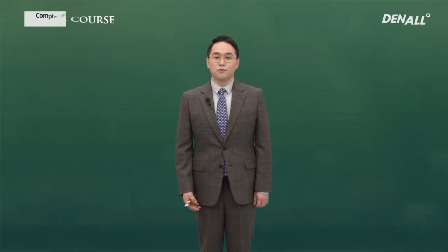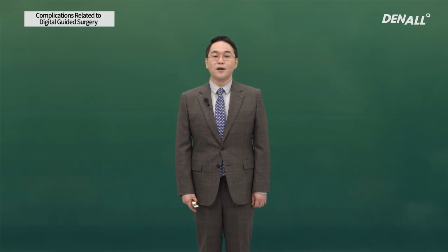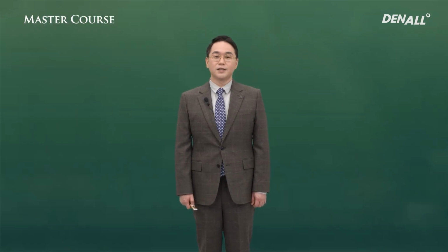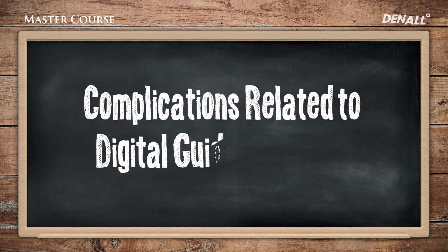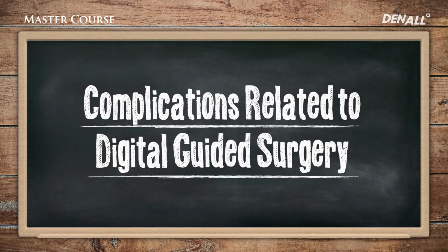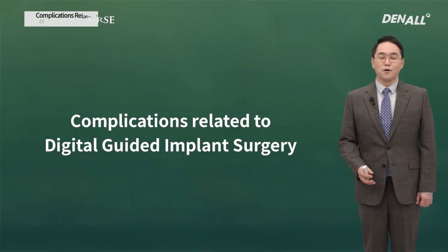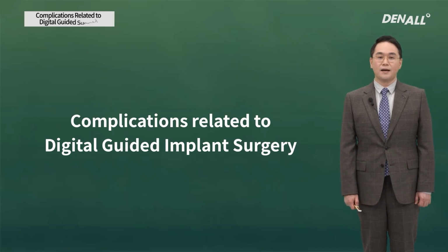However, if you use digital guided surgery without knowledge, there can be many complications. If you know the cause and reasons behind these complications, you'll be able to avoid that. In this lecture, I'm going to talk about the most notable complications related to digital guided surgery. First, when you do digital guided surgery, implant placement is not done as planned if you just drill on the hole in the guide.